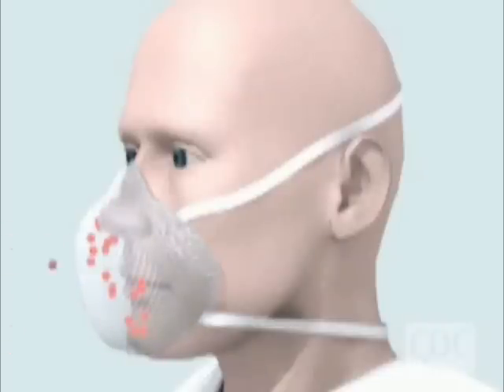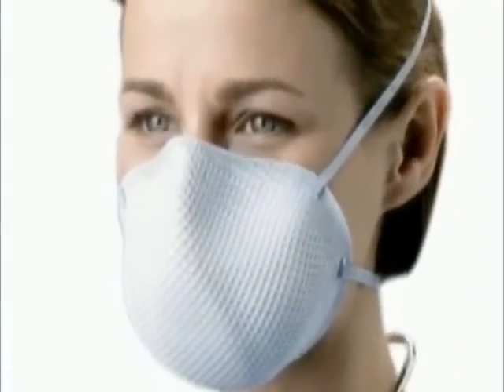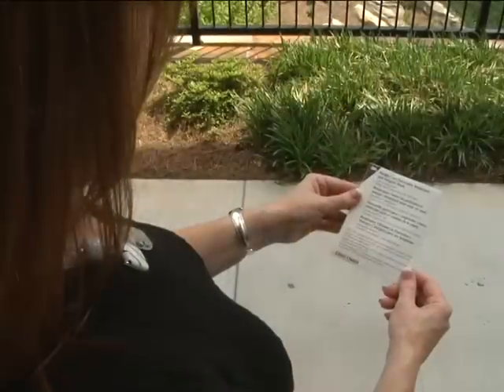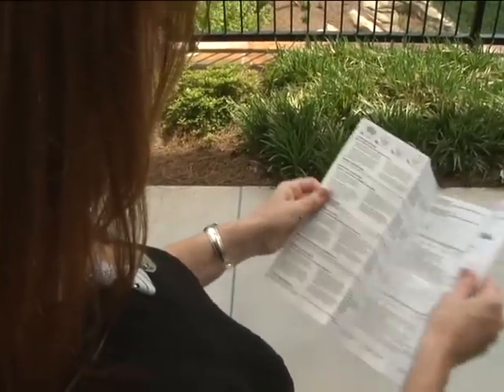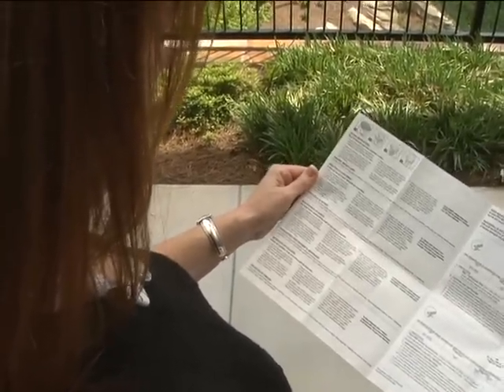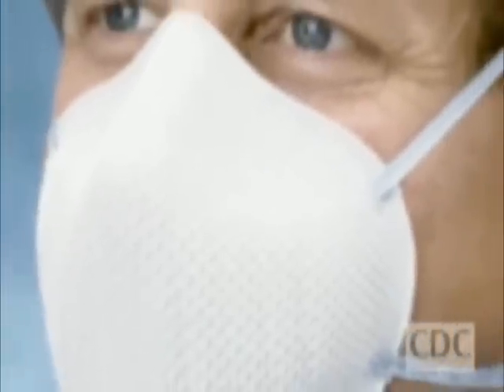N95 respirators are designed to protect you from breathing in very small particles that may contain viruses. These types of respirators fit tightly to the face so that air is inhaled through the filter material. N95 respirators should be worn only once and then thrown away in the trash. Manufacturers supply important instructions with respirators on how they are to be put on and checked to make sure they are properly positioned. Always follow the manufacturer's instructions specific to the product you're using.